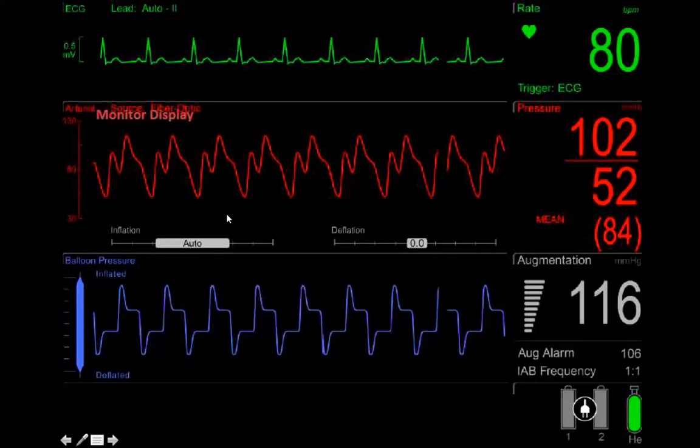One possibility is just that this is actually the same monitor as the intra-aortic balloon pump, and so it's all connected. So it's measuring this systolic blood pressure, the maximum just before inflation, and measuring the diastole just after deflation, and so excluding that and adding it here.